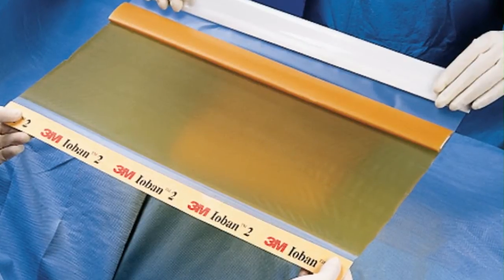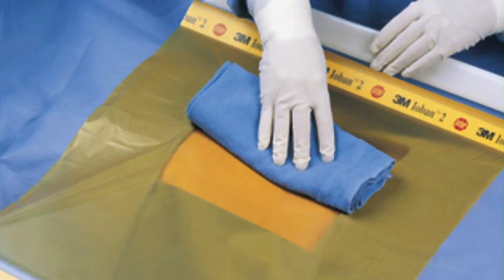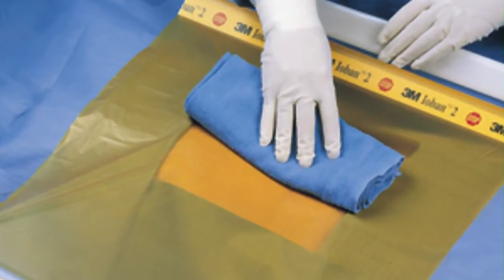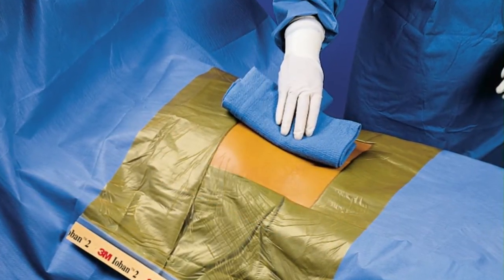These instructions do not apply to Ioban framed or Ioban specialty drapes. Prior to use, please refer to the instructions for use for complete instructions as well as all warnings and contraindications.